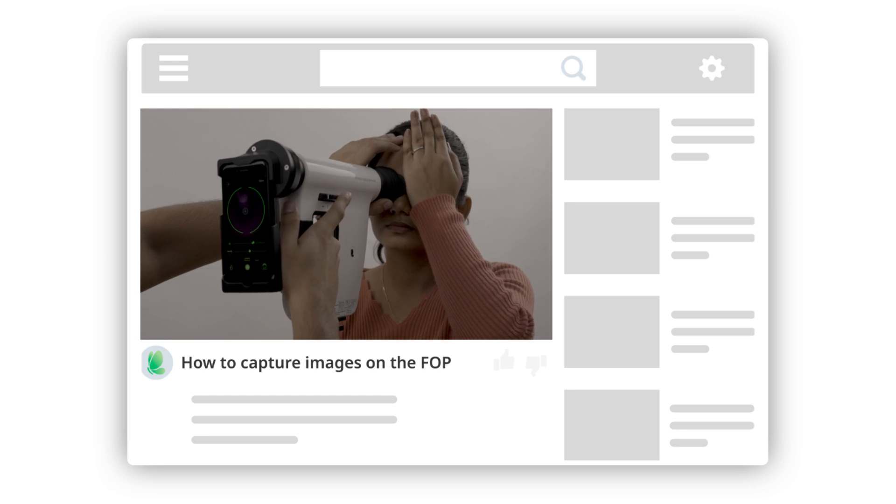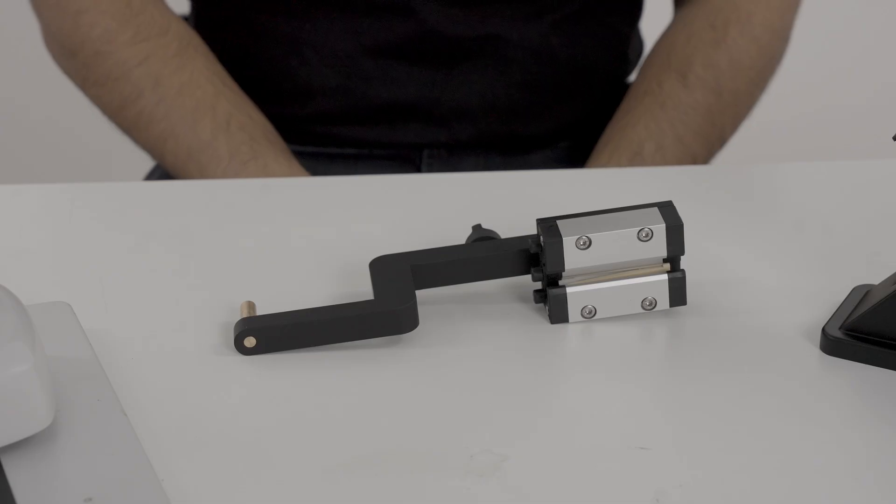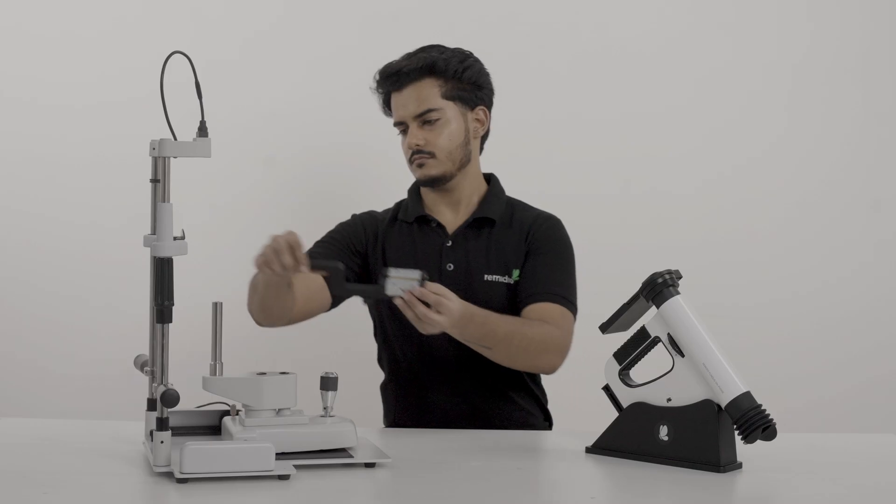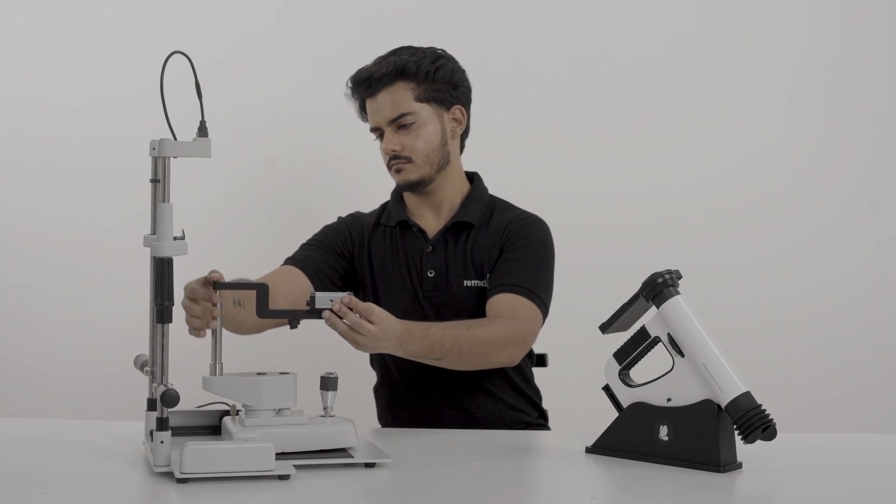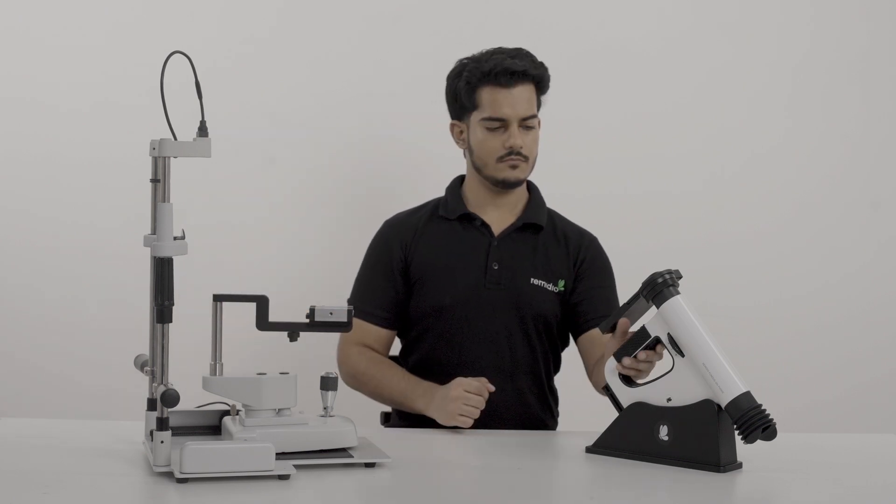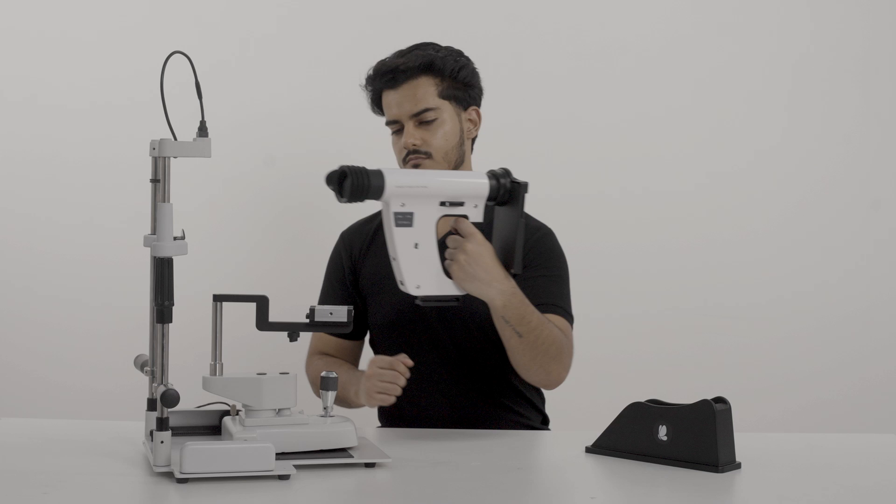To set up the FOP for chin rest use, first find this attachment rod and place it on the chin rest. Now slide the FOP onto the attachment rod.